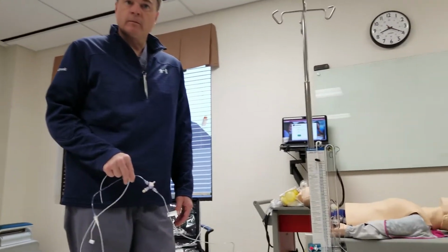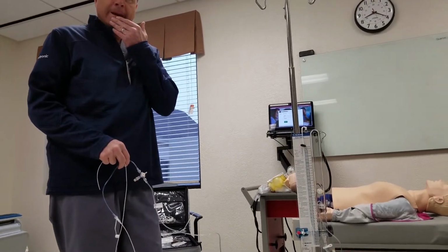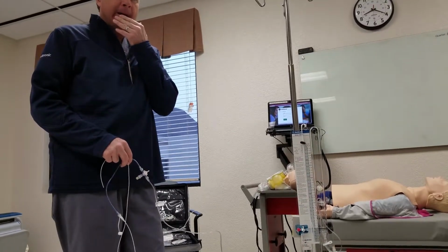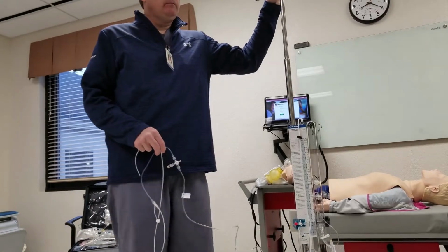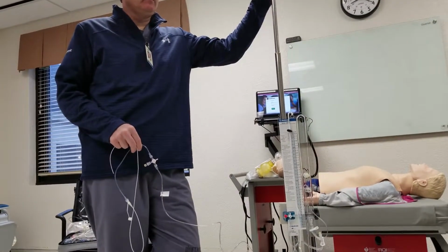So I guess we have to have 2 policies for the volume and the gravity. Ideally we are trying to get everyone to go towards volume. I think this was Dr. Pelosa's first. He told me lumbar drain in about 5 years. So obviously there's new things coming out.